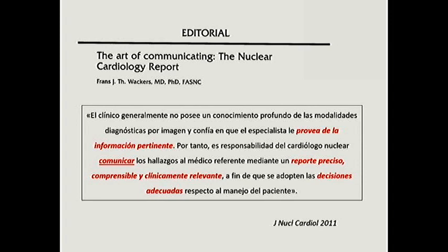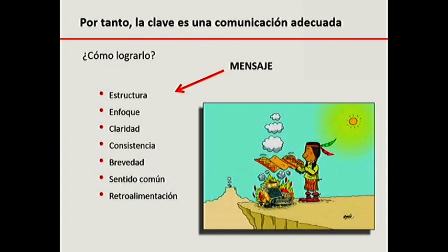And this part, the understandable and clinically relevant report, this is what we have to consider the most. So the idea is to send a message, right? To convey a message. The message has to be in an orderly manner. It has to be structured. It has to be focused, clear, consistent, and relatively brief. It has to have common sense, and preferably it should have feedback as well.